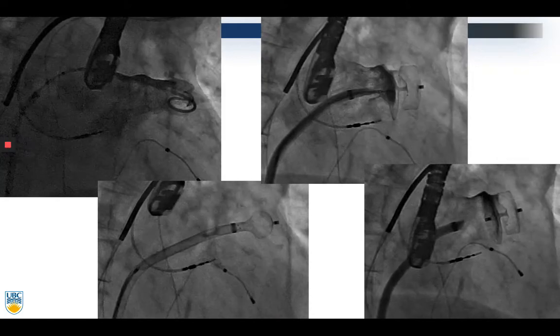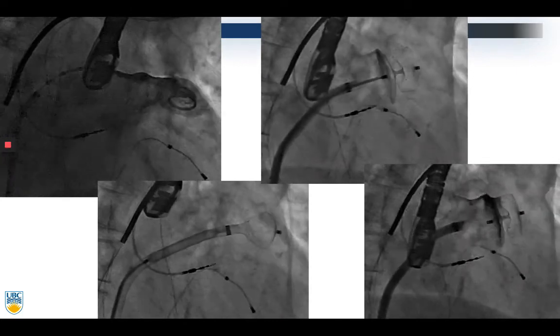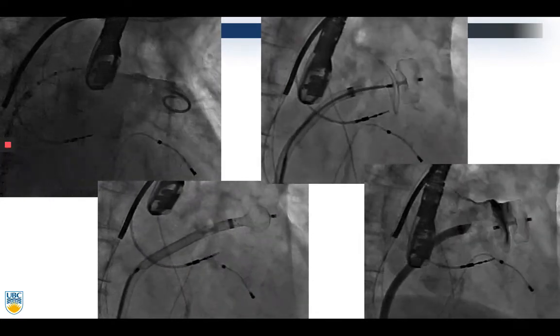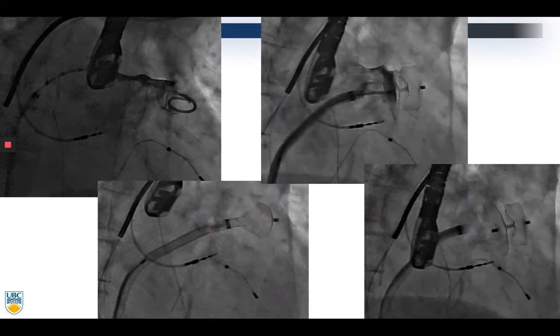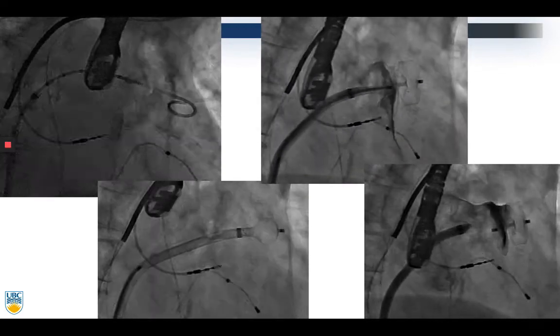So the first case example is a patient with a windsock-like appendage. The landing zone measured approximately 20 millimeters in this case, and we used a 24 millimeter ACP device. The procedure itself was quite straightforward. As you can see, the device had met the 5 signs for the ACP before release.